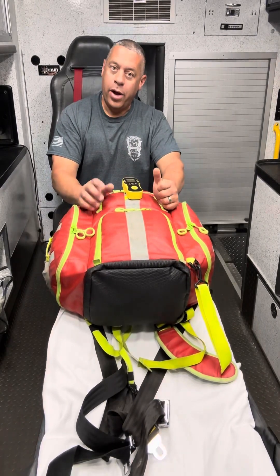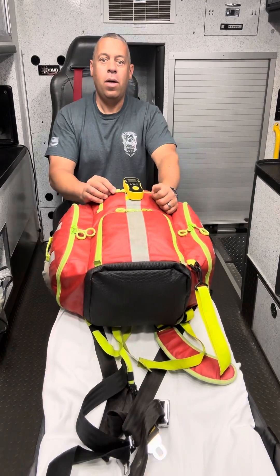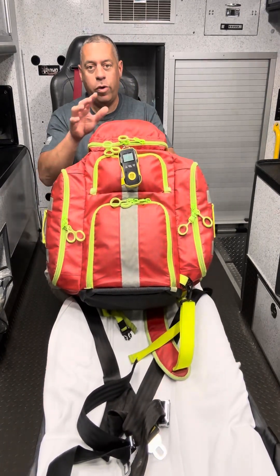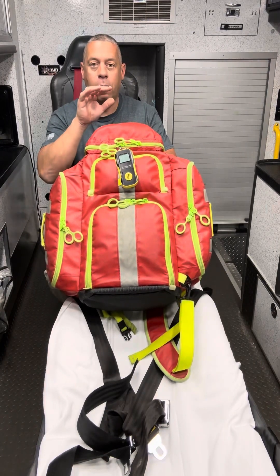Hi, I'm Justin Lima. I'm a paramedic and the EMS captain here at Harmony Fire Department. I'm here today to talk to you about our StatPak G3 Plus Profusion Bag, which is what we use currently for our first-in bag.